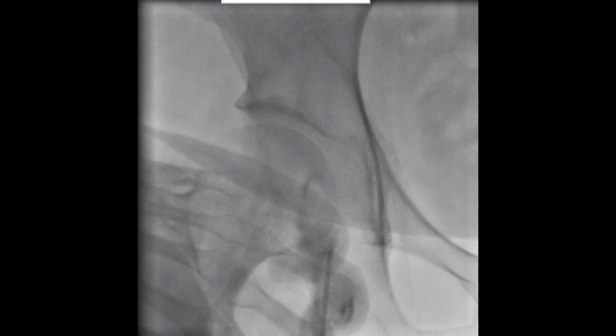We can see the femoral head, and the vein will be medial to the artery. We can feel the pulsation of the artery, and the vein is medial to it. Then insert the syringe at 90 degrees, with flushing, like insertion of a central line. Also, we can use ultrasound guidance. There are other venous accesses like subclavian and internal jugular, depending on the case.